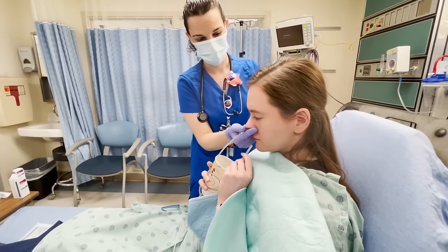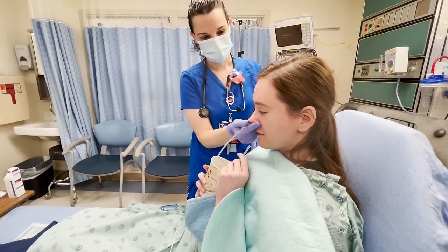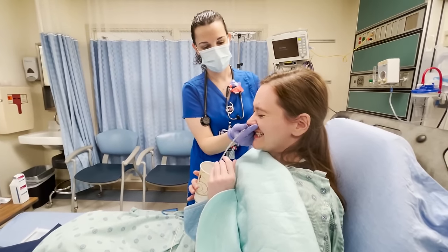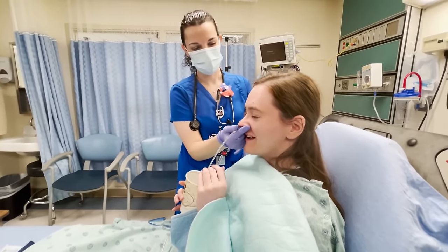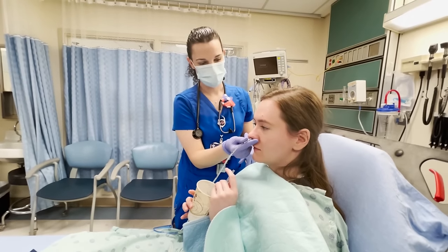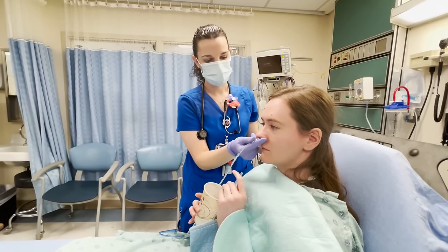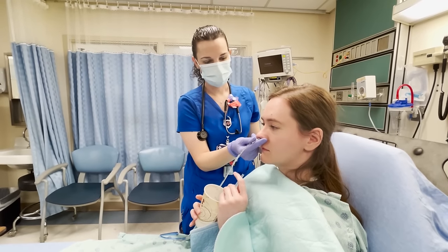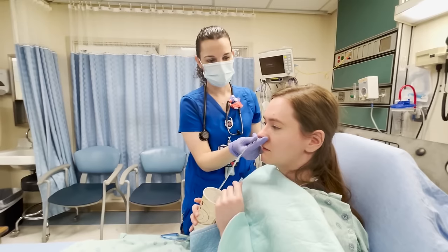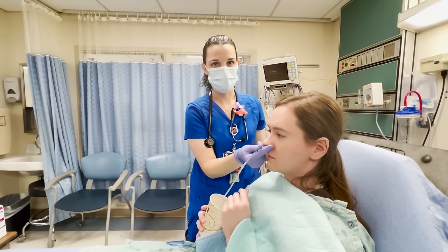Great job! How was it? So in all honesty, the look on your face was a little shocked as it was going in. This is your first time having an NG tube — were you adequately anesthetized? Probably need a little bit more. That's a good learning point. It felt numb beforehand, but there was more resistance than anticipated.